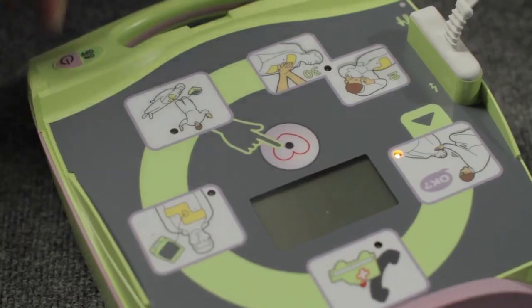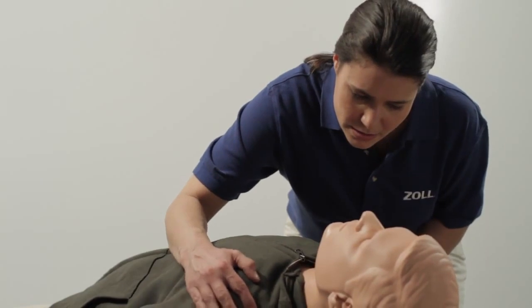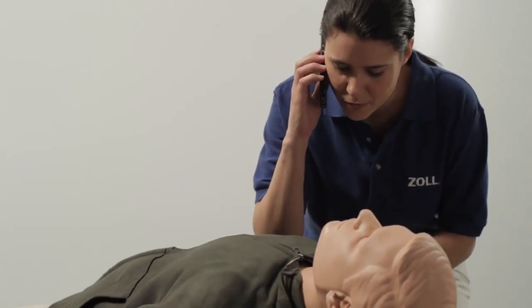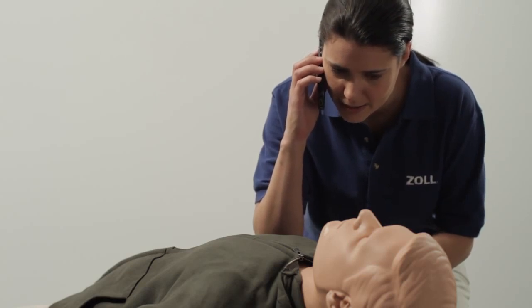Turn it on and follow the prompts. Stay calm. Check responsiveness — are you okay? Call for help. This is Julie Sanders, I'm at 445 North Park Avenue, and my friend is unresponsive. Please send help.